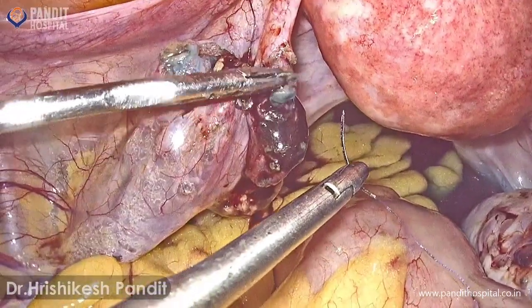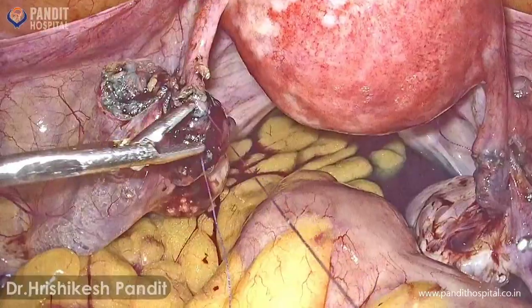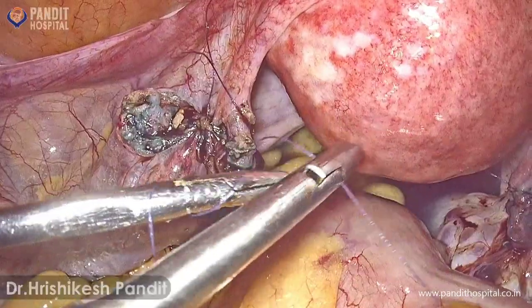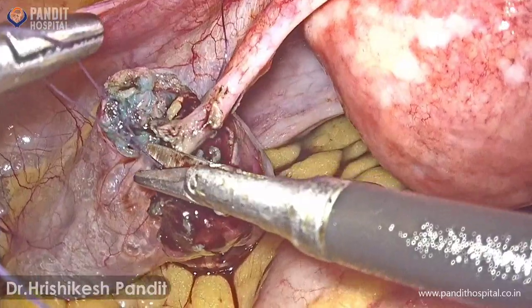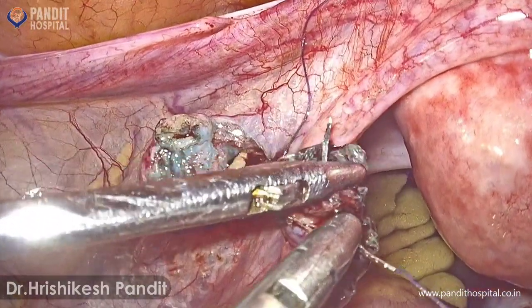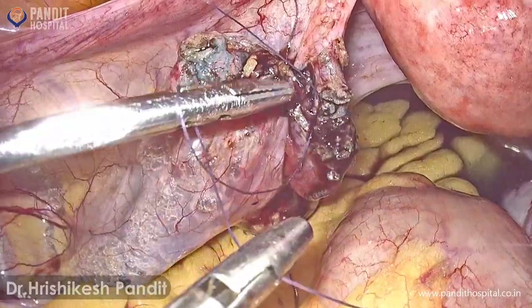The 6 o'clock stitch is over. Now we are taking the 3 o'clock stitch again from the muscularis to the mucosa and from mucosa to the muscularis. As we are having a larger lumen on the left side, we are not going to tie the suture at the end — we can easily pass the needle as well as evert the edges. So we are not cutting the thread and tying knots at the end on the left side, because it is a bigger lumen comparatively to the right side.